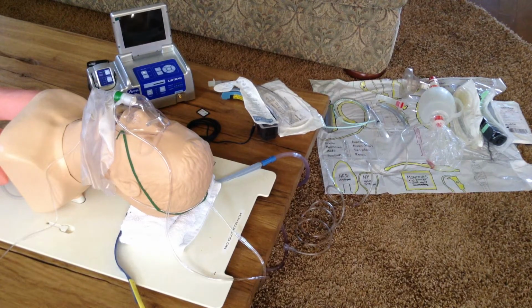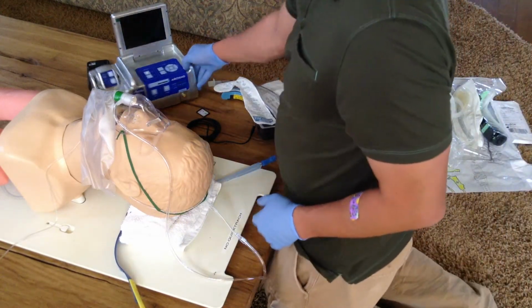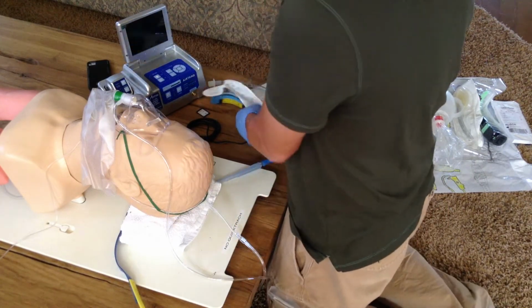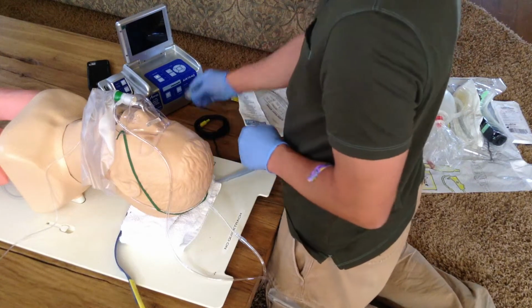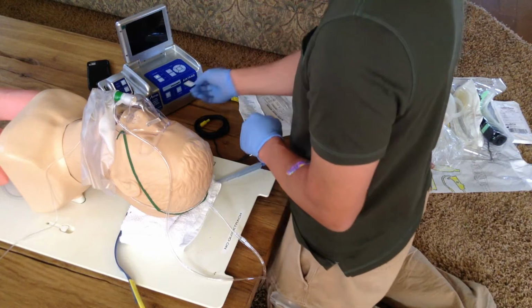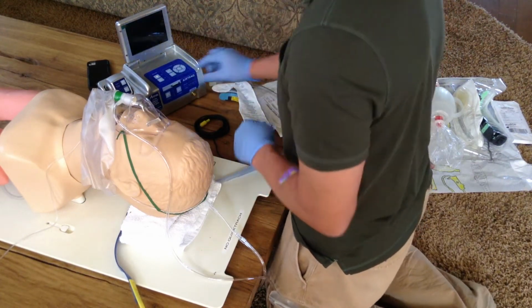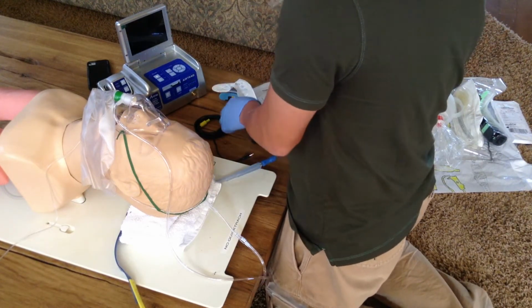So the video Airtraq has been set up already here, and it's fully charged and ready to go. And we've got our Airtraq ready here. We've got a cable if we need. We have the SD card for recording, and that goes in here. You just push it in until it snaps in place, and we've got our 8 tube ready to go.